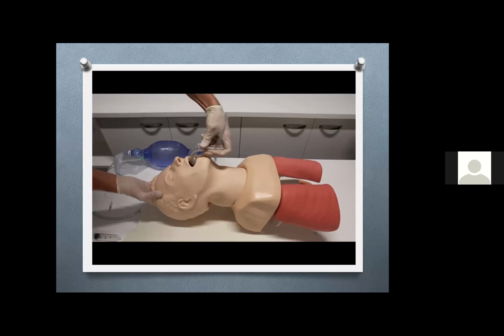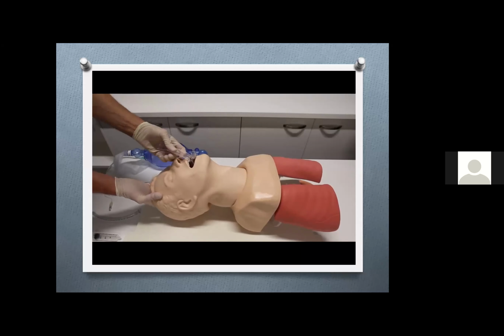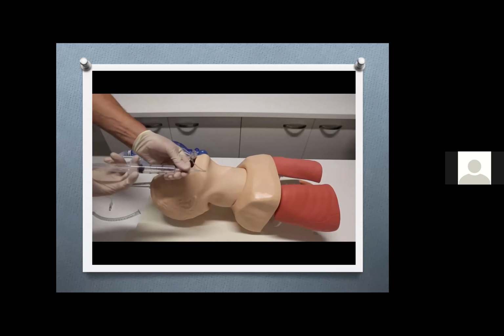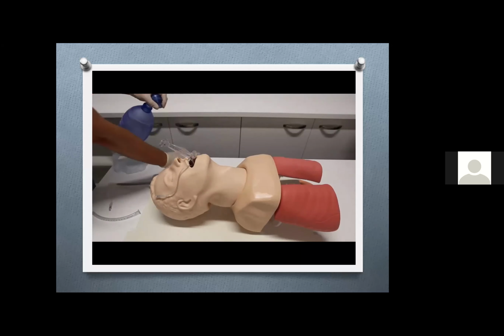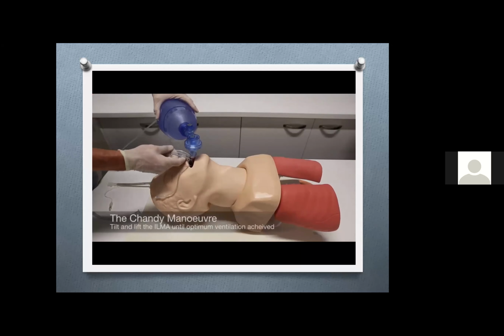So after he is back, he's easy to ventilate. See how he just put the LMA in and used the handle to push it down. Now the LMA is in place, you just inflate the cuff and check whether it is in an effective position. You can't see; it's a blind procedure.